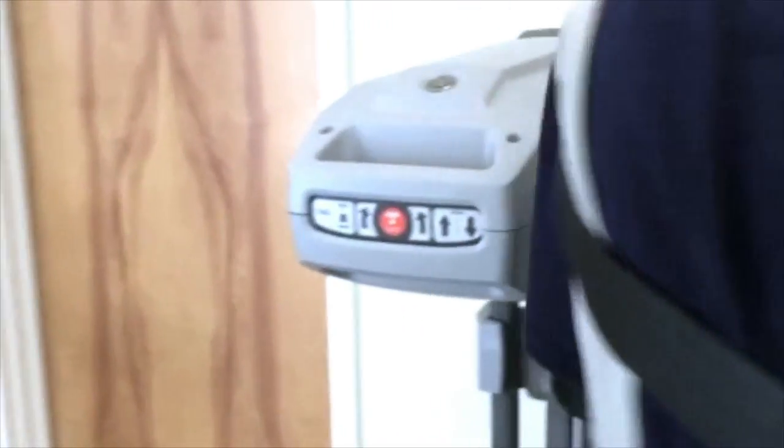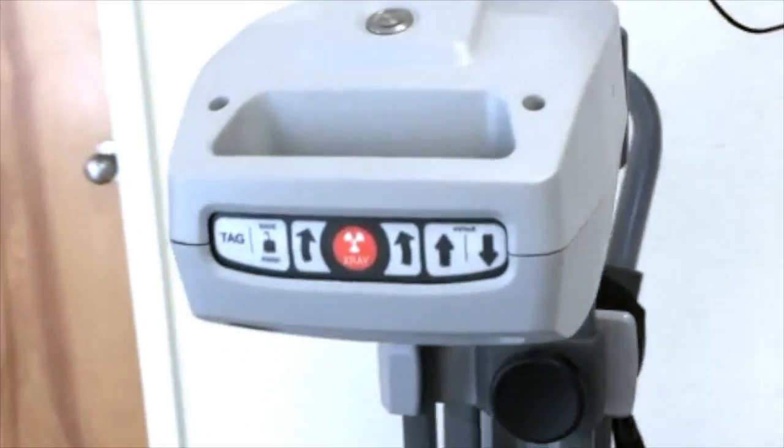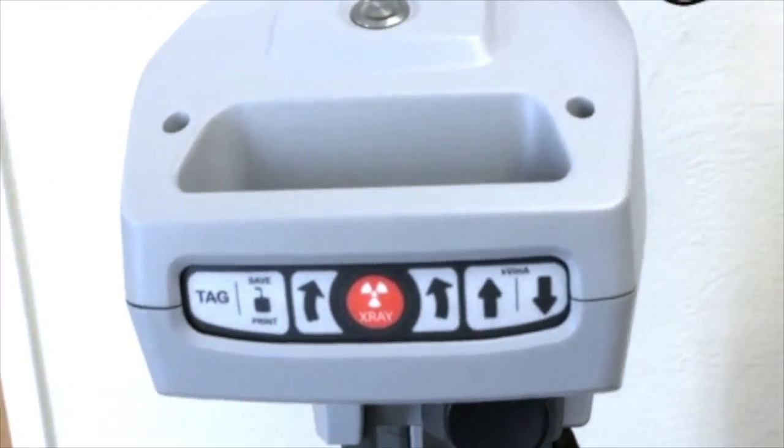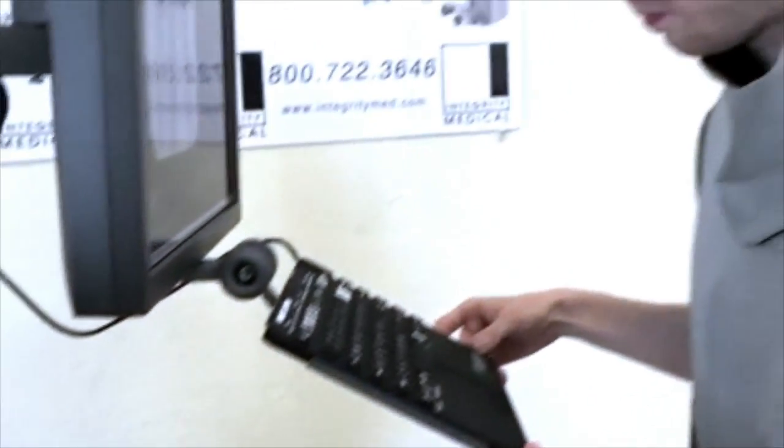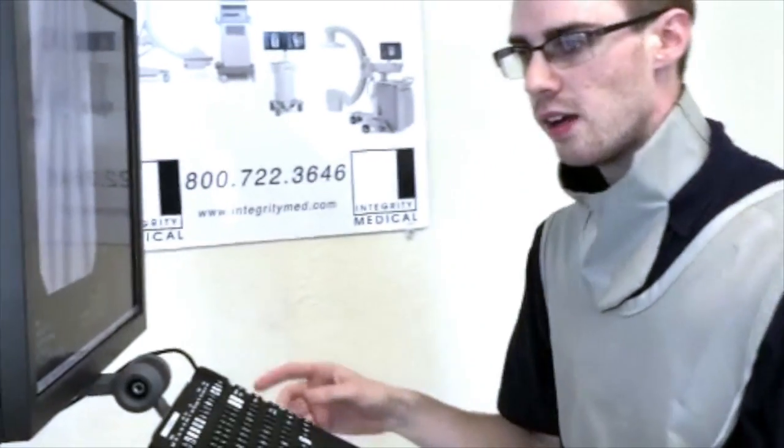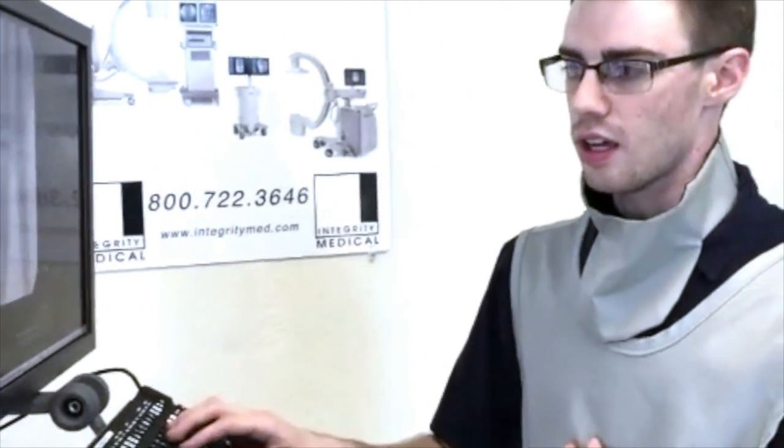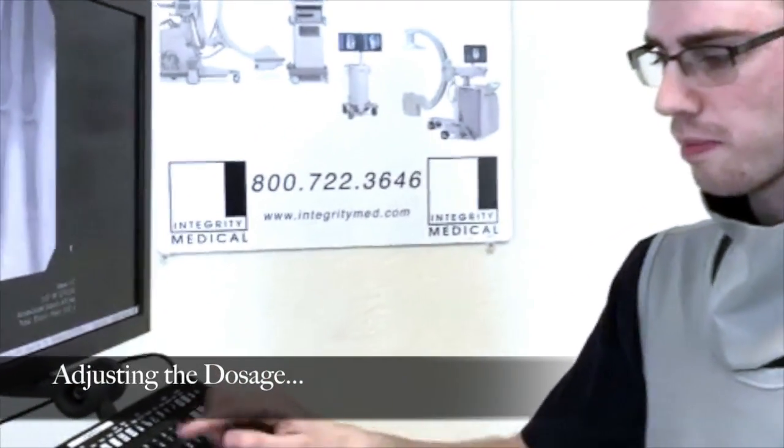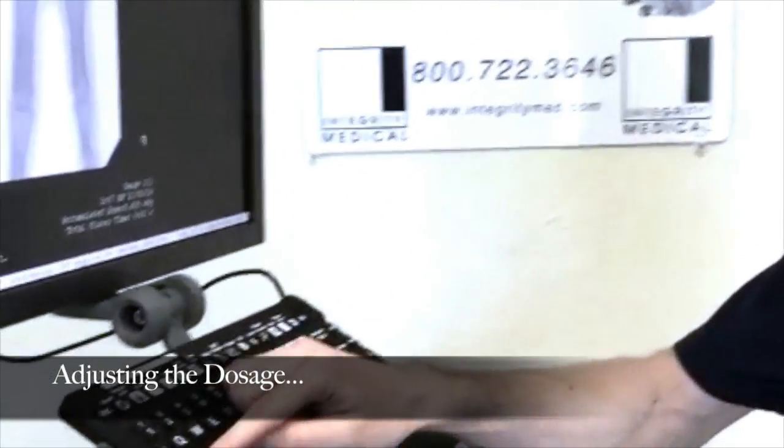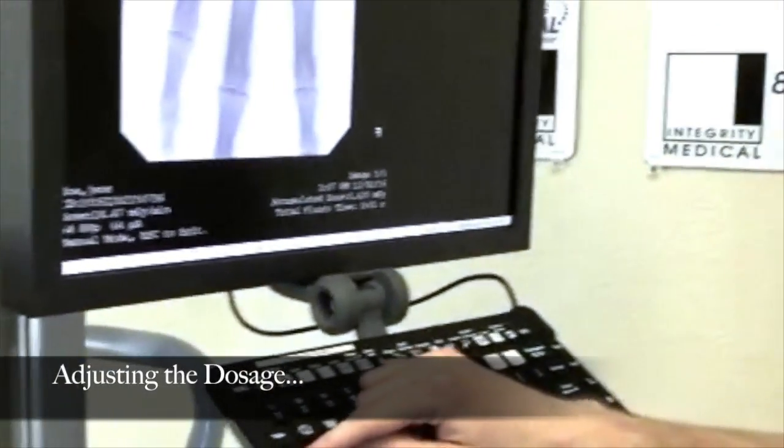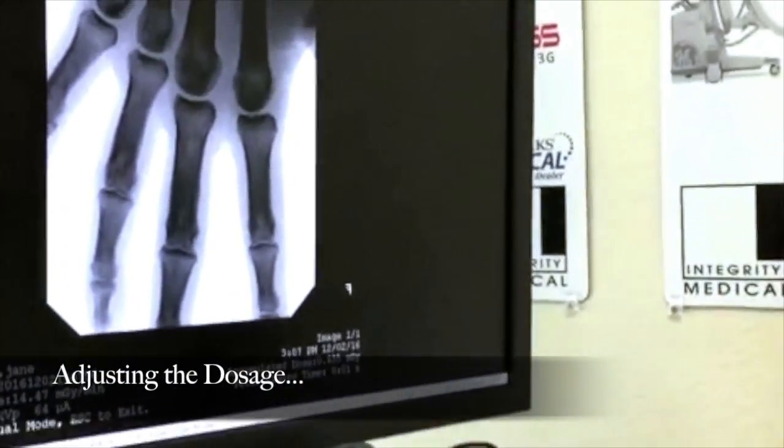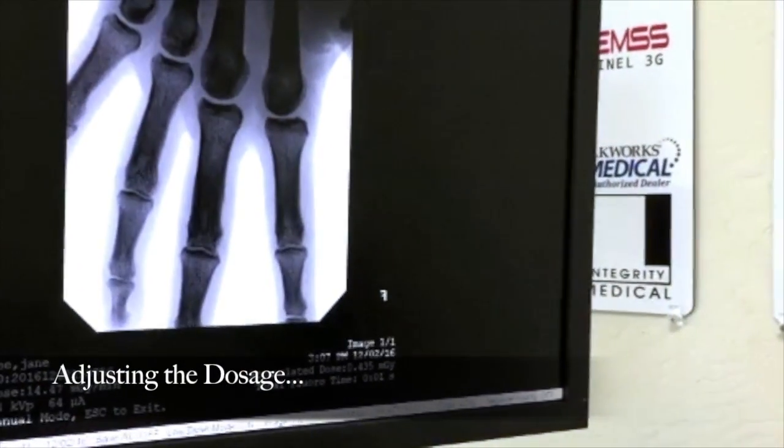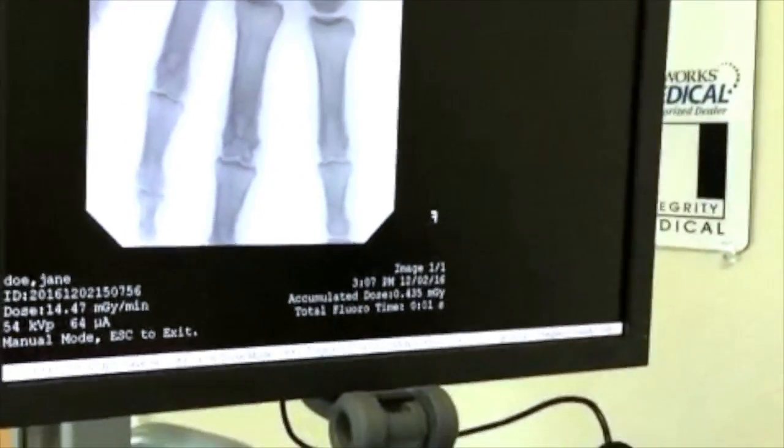Another interesting feature is you can adjust the dosage before you do an exposure by pressing the mode button right here. You can decide whether to shoot on low dose or high dose.